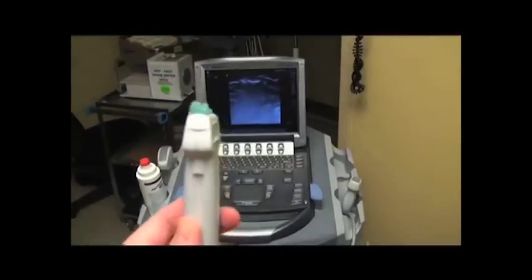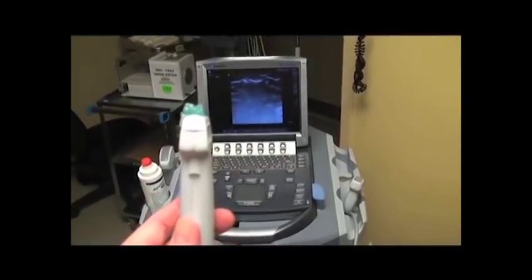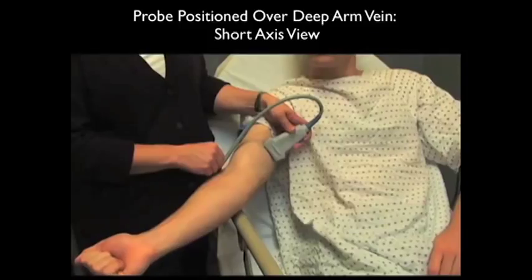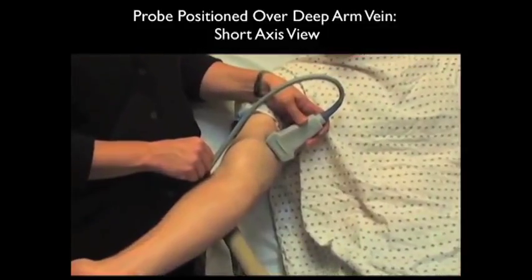Here's the high-frequency linear type array probe that we'll be using for vascular access, and that line on the side is the indicator marker on the probe. Here's the high-frequency linear type array probe placed on the patient's upper arm.